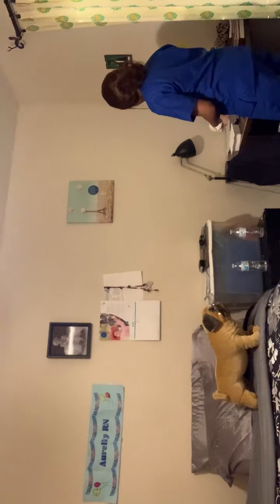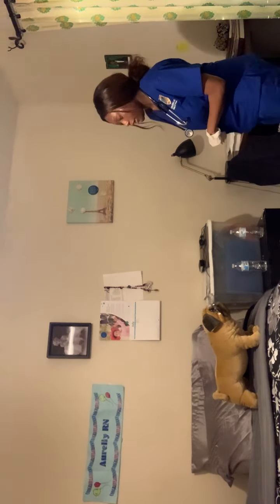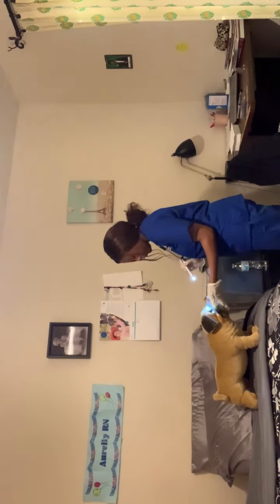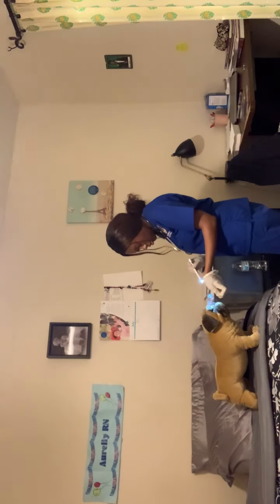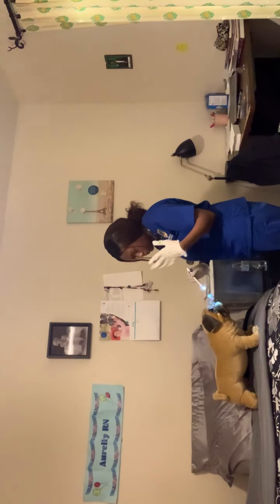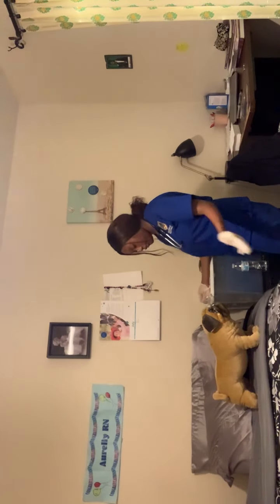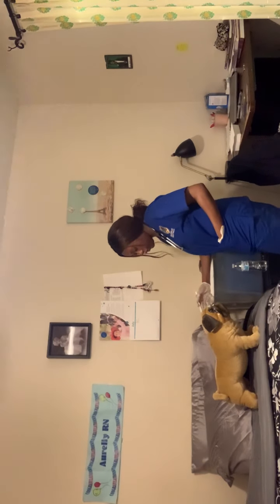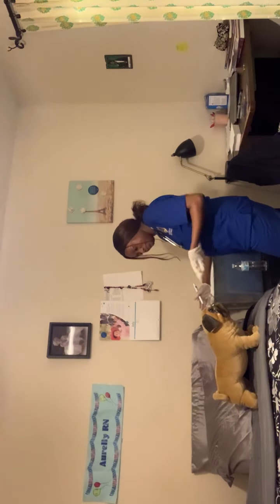And so now I would come and inspect her nasal areas. So I would check her nasal for any obstructions, any nasal polyps, any irritation, or septal defect. And then I would see that she's okay, and then I would go ahead and verify with her. All right, Ms. Dog, I see that you didn't have any problems on your chart, but I just want to make sure if you've never had any recent nosebleeds, any nasal surgeries, or any nasal trauma.